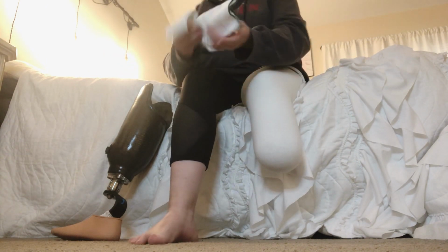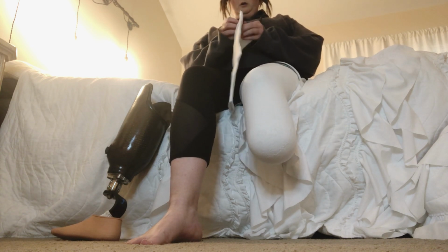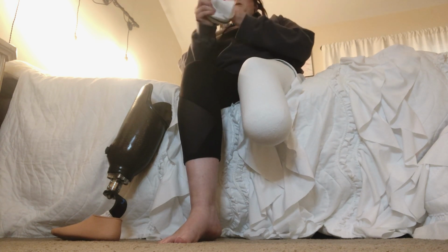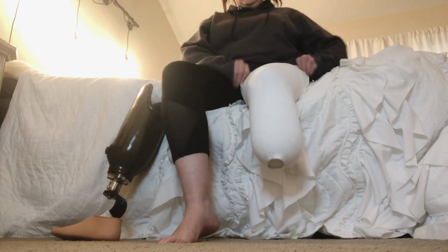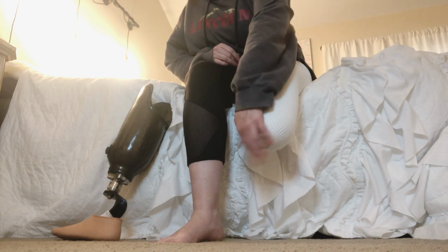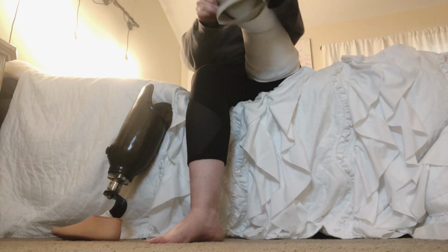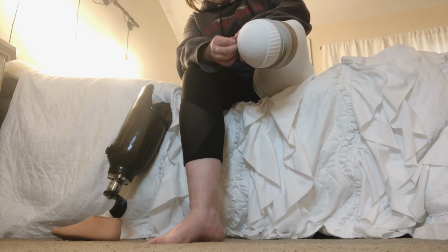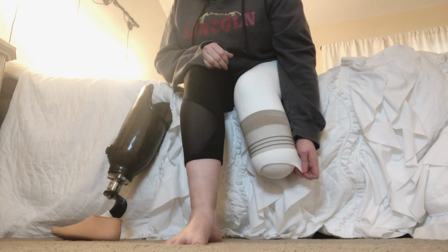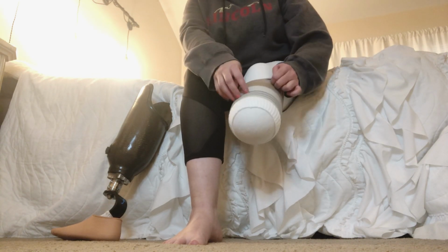I'm going to take off the 1 ply and add another 3 ply that doesn't have the foot part. So I have 5, 3, and 3. Well, this sock is kind of annoying because it doesn't have the bottom, so it pulls up whenever I put my rings on.